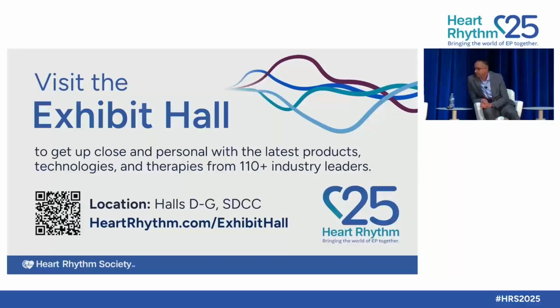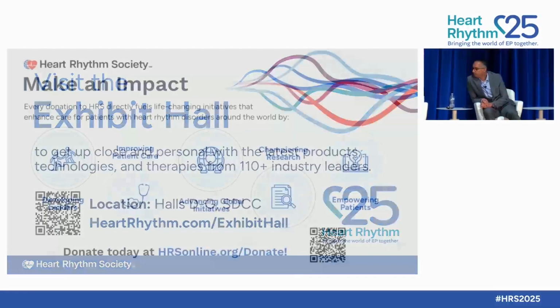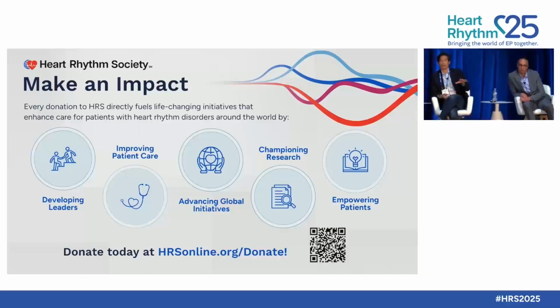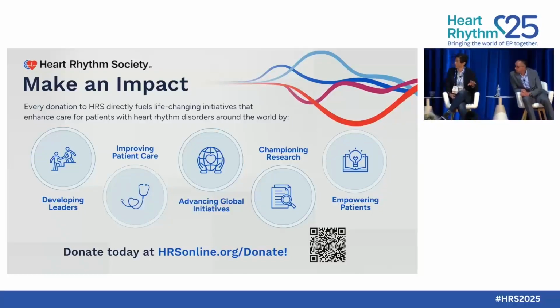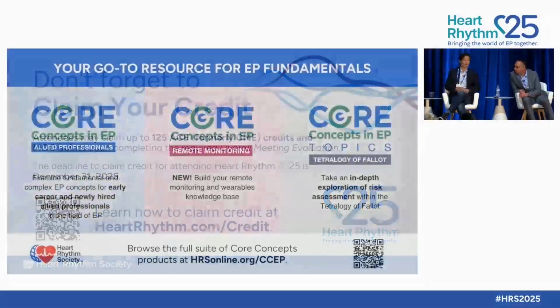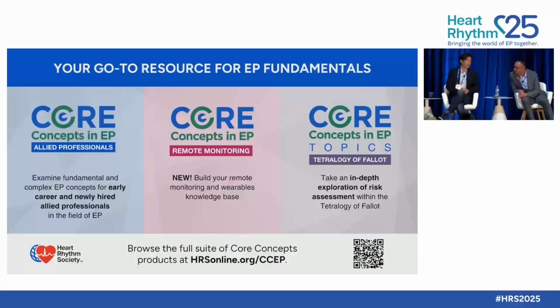Yeah, and if I could add a quick point to that, Vivek, one limitation of all the data here is we really have no guidance on how much ablation to do at each site. If you specifically focus on RF, there's no guidance that you have to use an index, or ablate to this amount of time, or this endpoint, or impedance drop, or whatever it is. So if you're in a thick part of the atrium, you could be under-ablating. So these are potentially reasons for recurrent atrial tachycardia.